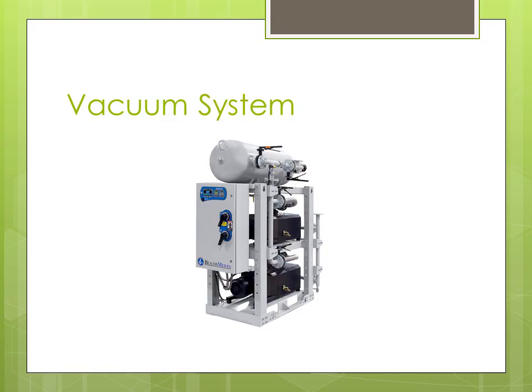So vacuum, all medical gas systems are critical, but I think vacuum is one of the ones that once you lose vacuum, it really creates a very quick reaction. Typically inside your hospital, you'll have other redundant systems, little portable vacuum systems that are used for emergencies and for backup.